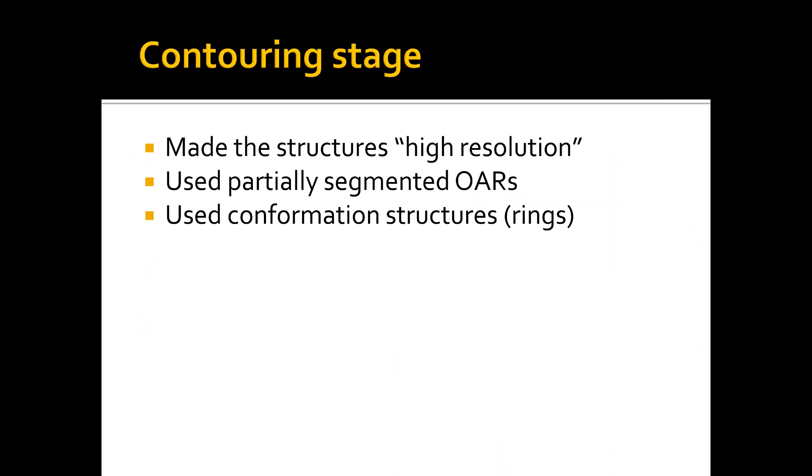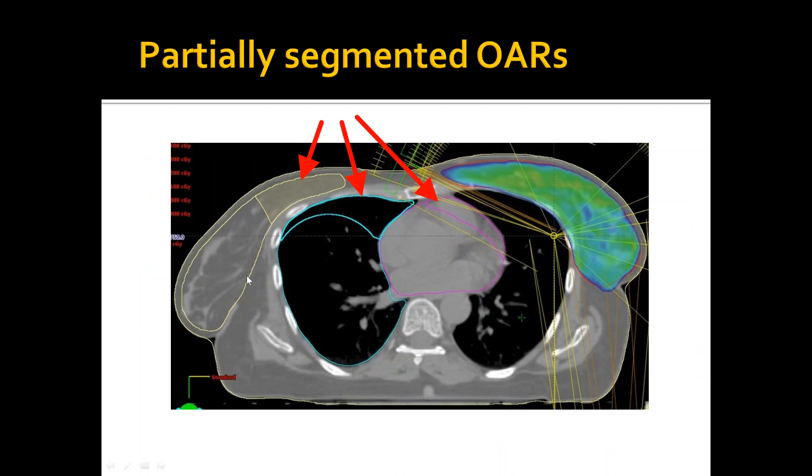In the contouring stage, I made the structure of high resolution. I also used partially segmented organs at risk, and I used conformation structure rings. These are the partially segmented organ at risk. If we see this is the right breast contour, the small contour is the partially segmented organ at risk. I used this structure to push the dose out of this region more in order to stress on the optimizer that I want the dose out of this region. I have made one also for the right lung and for the heart as well, as we can see here.